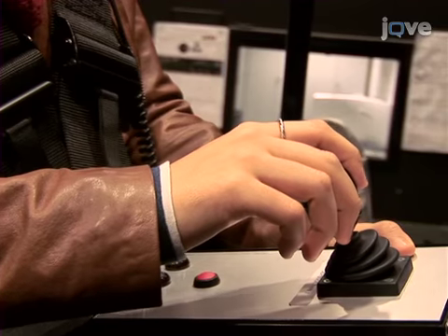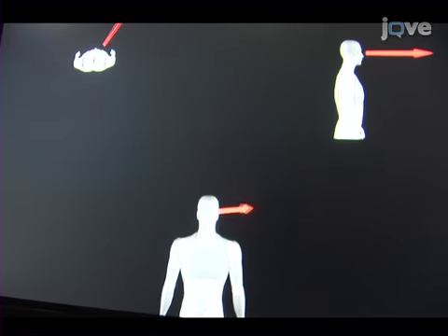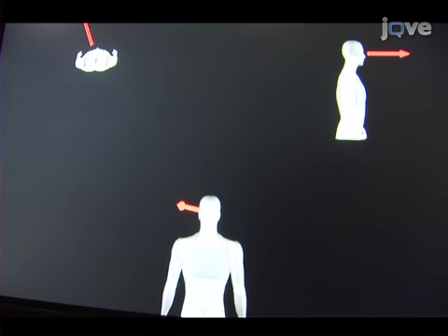To provide feedback of their perceived movement, participants move an arrow with the joystick to indicate their movement relative to their origin. The origin is presented as an avatar, from 3 points of view, and the arrow is always randomly positioned prior to adjustment.